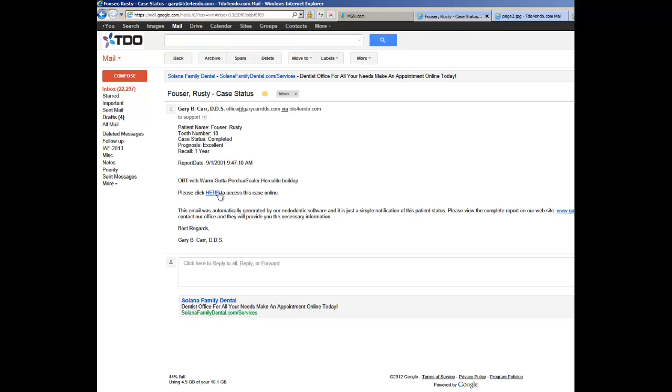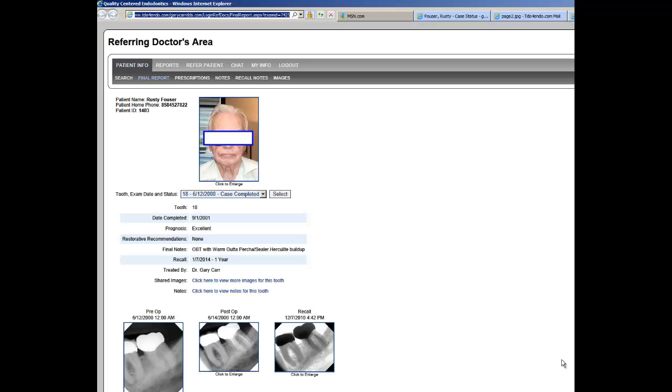as well as a link to access the full case information on your website. When the referring doctor clicks this button, it takes them directly to your website, directly to that patient's final case information.